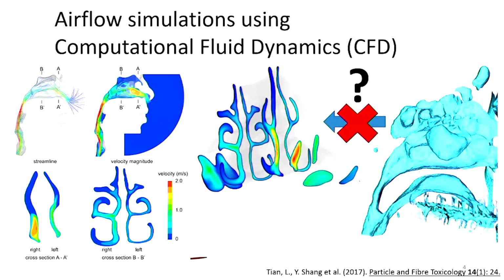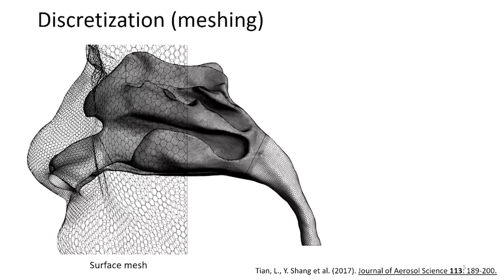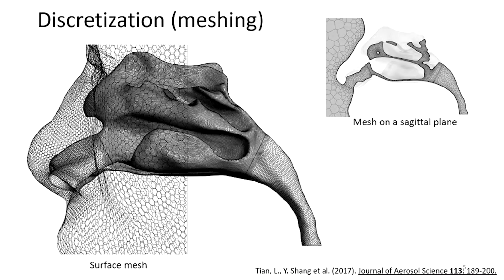Unfortunately, the answer is no. This is mainly because to perform CFD simulation, we have to build what we call discretization, or meshing. And this meshing process requires a very clean CAD model. Otherwise, if the mesh quality is low, you never get a correct CFD result. Or sometimes the residual doesn't converge, or even diverges.